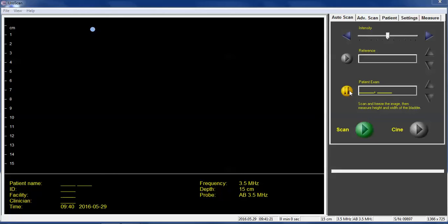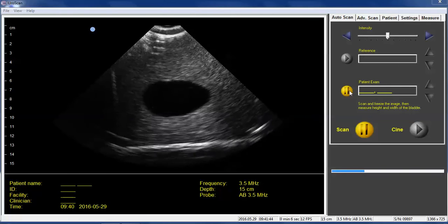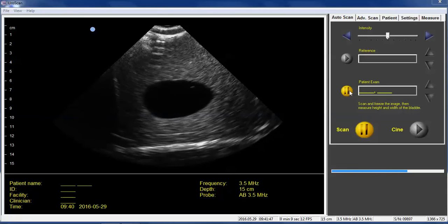So now at this point, the system is ready to be used. You can use the wand or probe to get an image of your bladder. So you position the wand so that the blue button is facing the patient's right or left hip, and then push the button when you're ready. So I'm going to push my button here, and then when you have a good image on the screen, you push the button again to freeze the image.